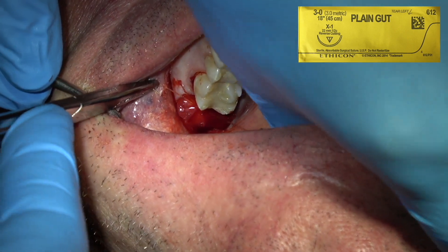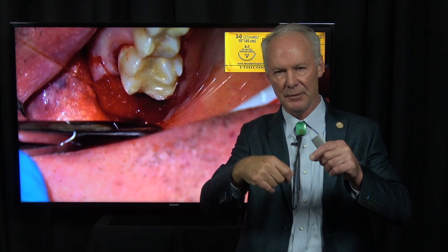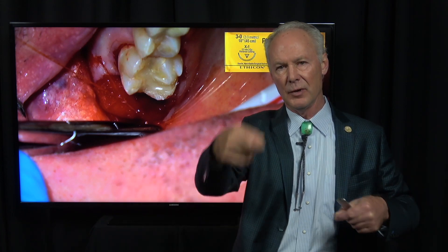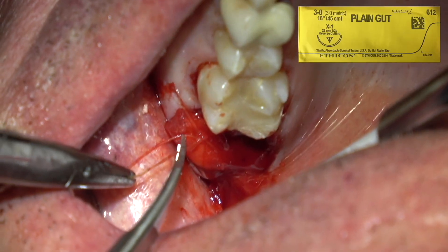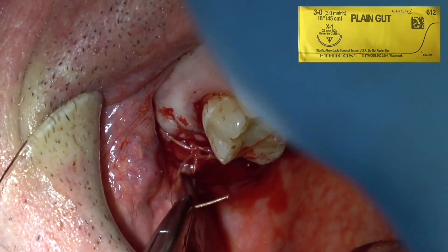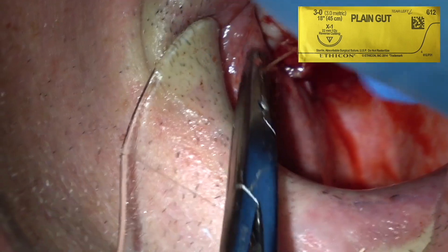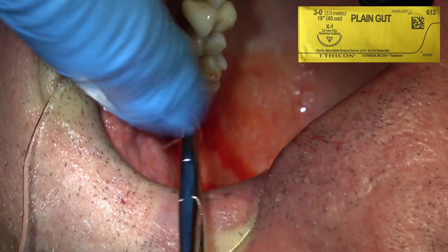Now here's a trick with suturing, especially if you're using gut suture. You've got the two ends of the suture — hold the needle part, wrap it one, two, three times and pull. Then one time towards you and pull. Then one time away from you and pull. The three wraps the first time will secure the suture. If you just wrap it twice and pull, it may be loose. But if you wrap it three times, then once towards you, then once away, the three times on the first pull will keep it in place.